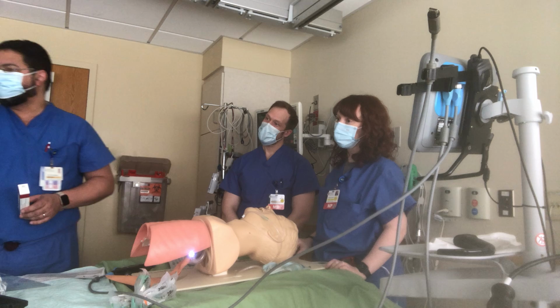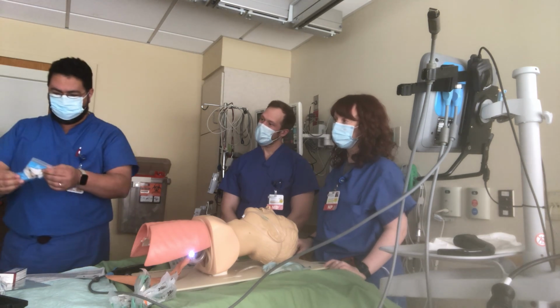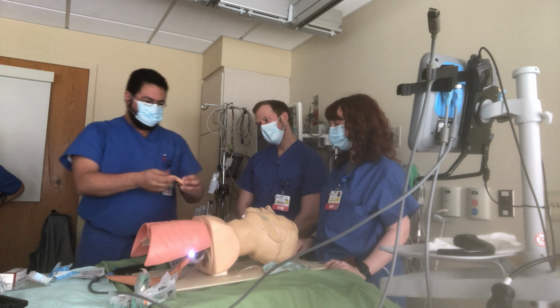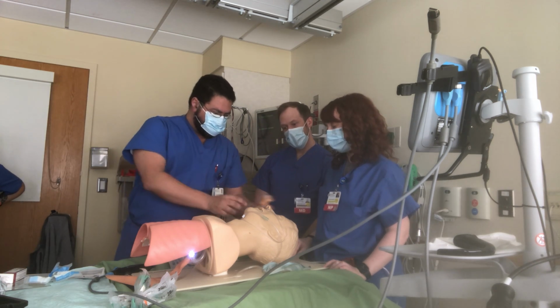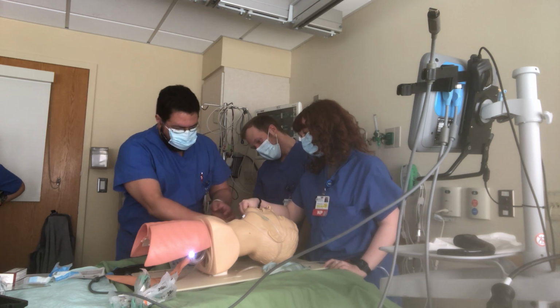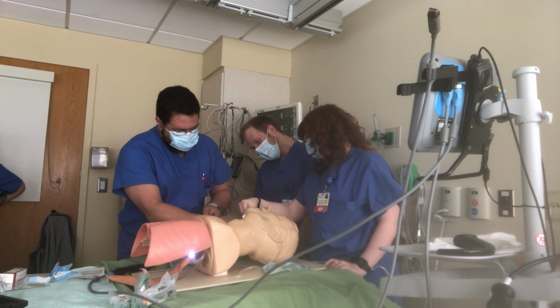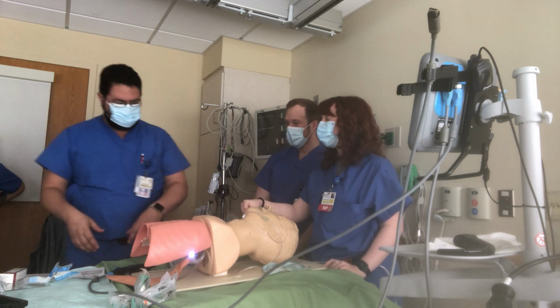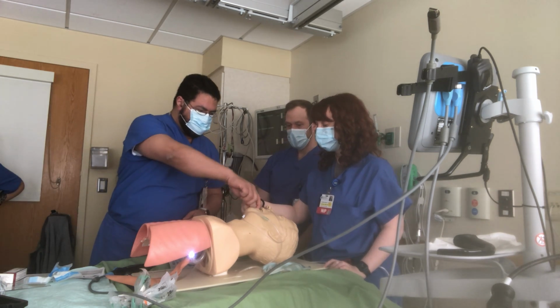This is called the Williams airway. This is the best airway. There's two sizes, large and small. This is small. So you're going to measure it against here. This one goes to the zygoma, and it has to pass here, past the angle of the mandible. So this is too small for this guy. So let's say we got the large and we put it exactly in the middle of the mouth.